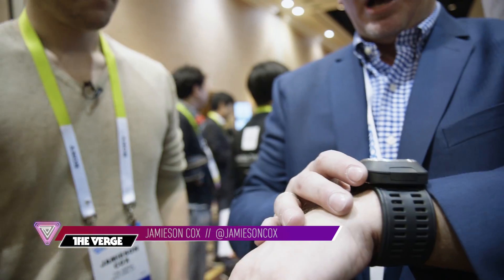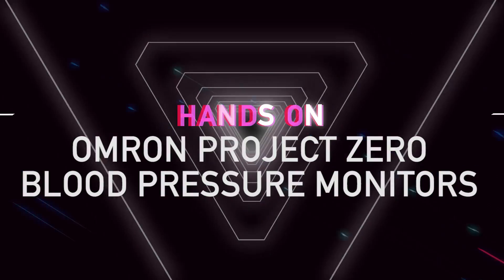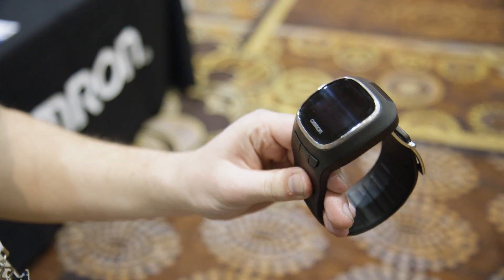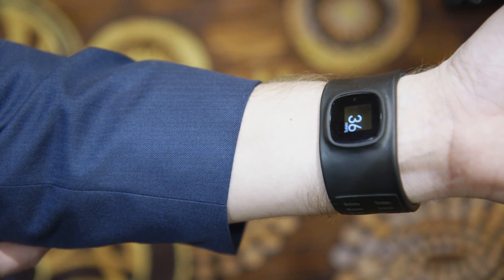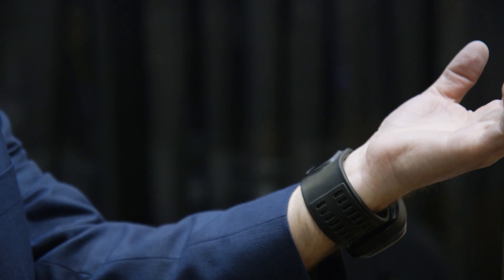This is Jameson Cox here at CES Unveiled and we're looking at Omron's Project Zero wrist blood pressure monitor. The interesting thing to note about Omron's monitor is that while it is a wearable — a familiar form factor like what you see with Fitbit and stuff like that — it's more intended to be a medical device than a casual wearable that you would use to track your steps or monitor your physical activity.